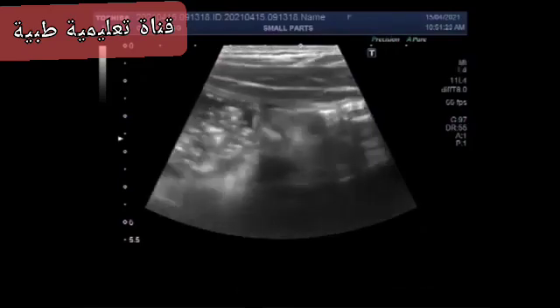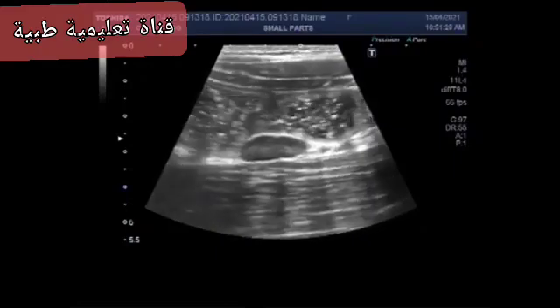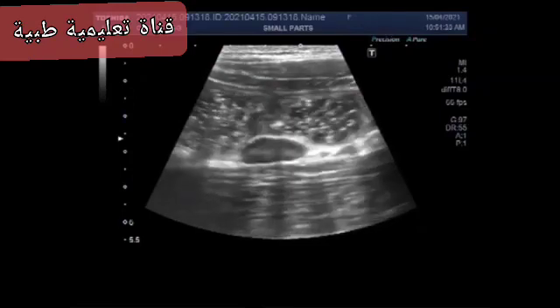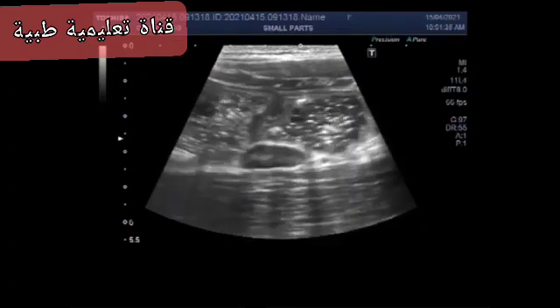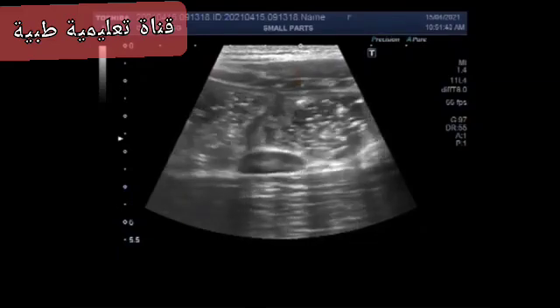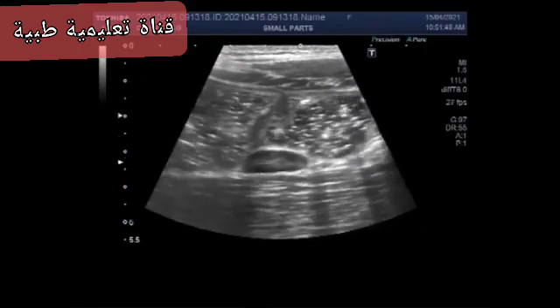Sonographic criteria for the diagnosis of appendicitis include a non-compressible, blind-ended, aperistaltic tubular structure in the right lower quadrant arising from the base of the cecum. The appearance of this inflamed appendix is hyperechoic with an echo-poor abscess surrounding the appendix.